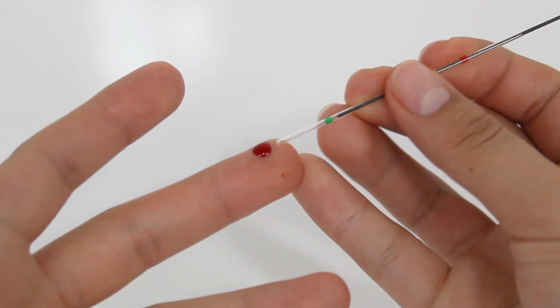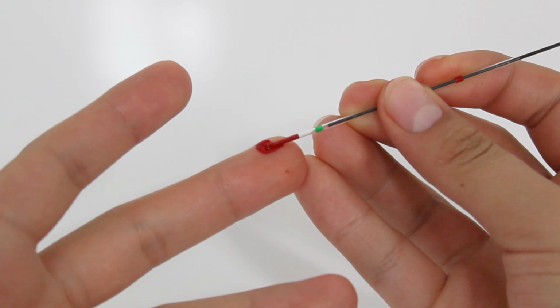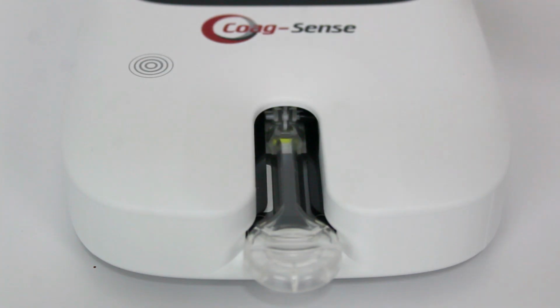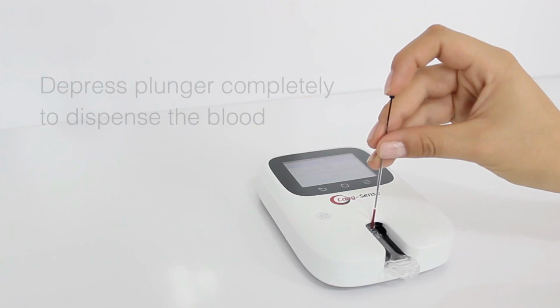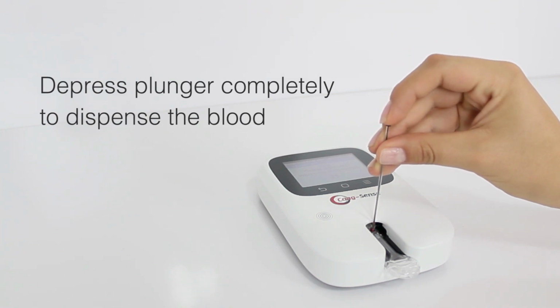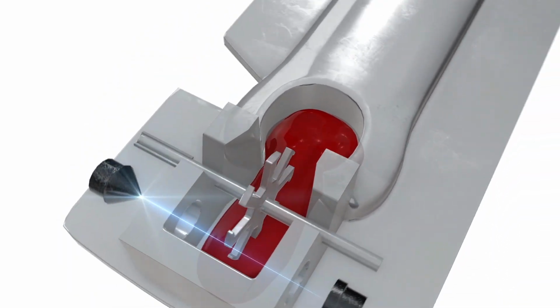Holding the transfer tube horizontal, touch the tip to the bead of blood and let capillary action fill until blood flow stops at the green band. Insert the transfer tube tip into the sample application well of the test strip and touch the tip down at the flashing green light in front of the spinning wheel. Depress the plunger completely to dispense the blood. The light should go out and the meter should display "Testing, please wait."